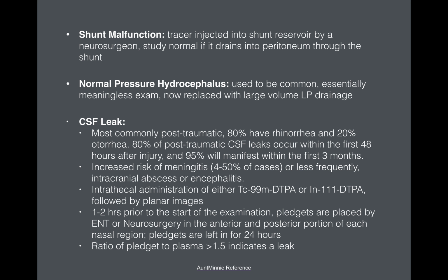CSF flow tests are performed with intrathecal injection of radiotracer, or injection of the shunt reservoir by a neurosurgeon, and then we can follow the CSF flow or identify the leak, particularly if we're using pledgets that are packed in the sinuses and then removed by an ENT surgeon. If we're imaging the pledgets, we have an increased ability to detect the leaks.